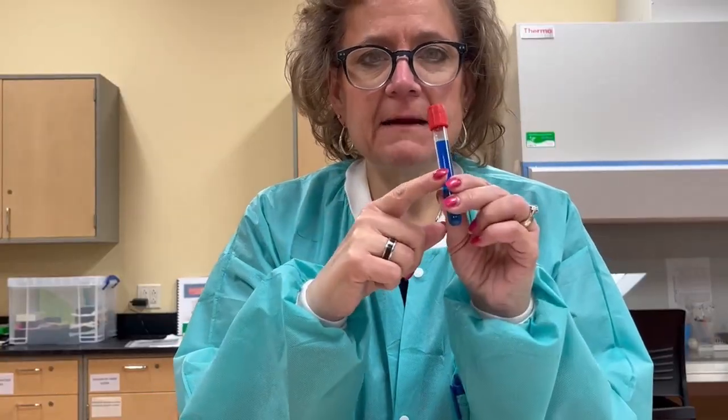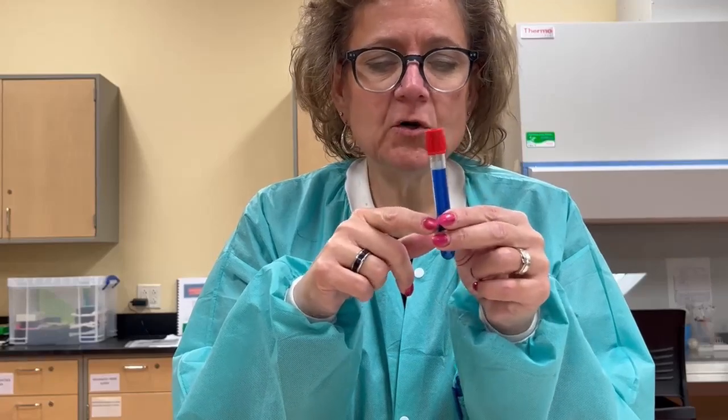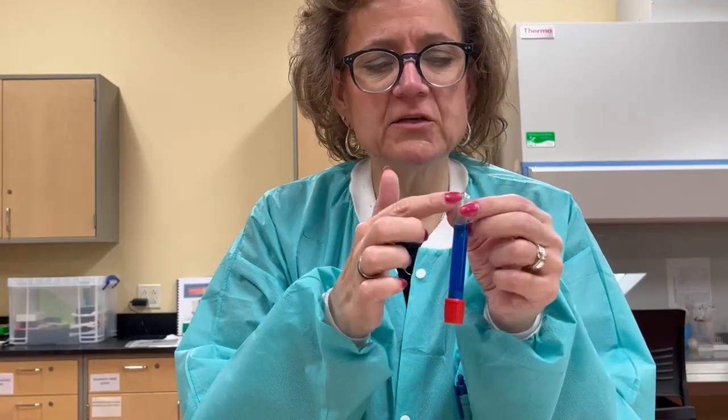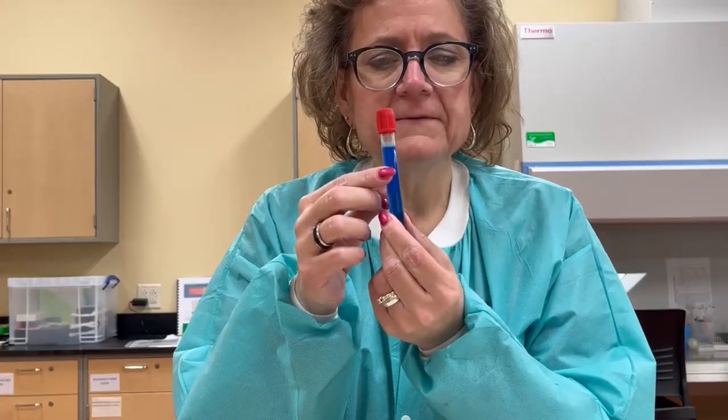Something I want to show you is this example of this tube. So this is a tube that when you're mixing it, look how long it takes for the blood to actually fully invert all the way down. Upside down and back — that's one complete inversion.